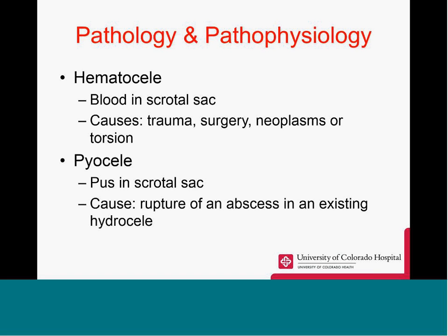Hematoceles, it's blood within the scrotal sac. Most common cause is going to be post-trauma, surgery, possibly due to a neoplasm or torsion. These are less common than a simple hydrocele.